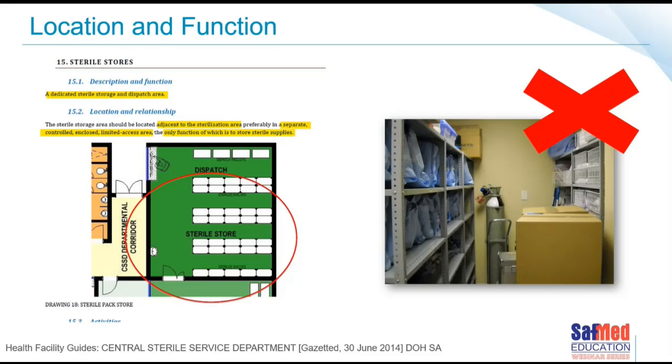So what can we do under our given circumstances if our sterile storage area isn't ideal or isn't what it needs to be? So we need to take this into cognizance and look at all of these factors that we're going to cover today, and hopefully we can find a way to work around our circumstances, or even better, design properly.